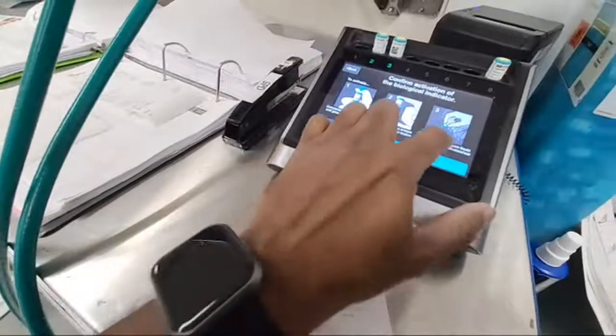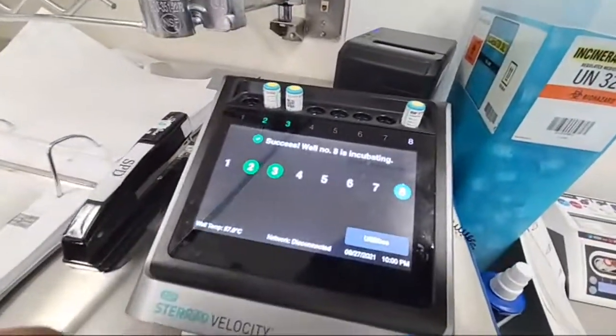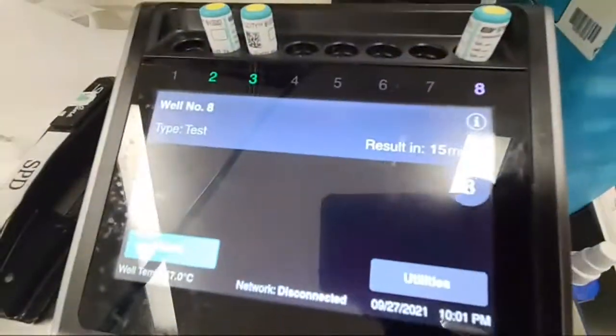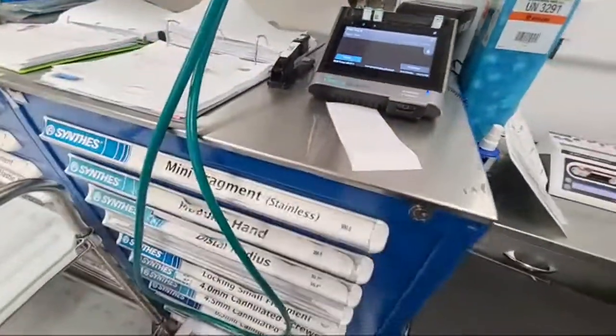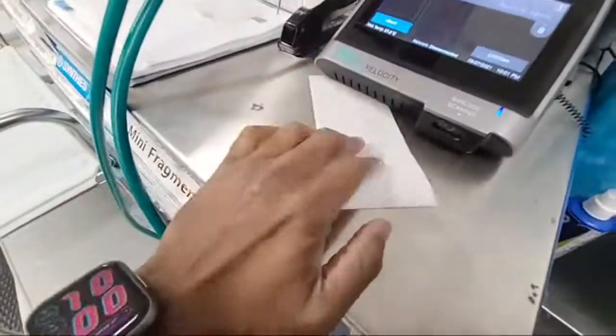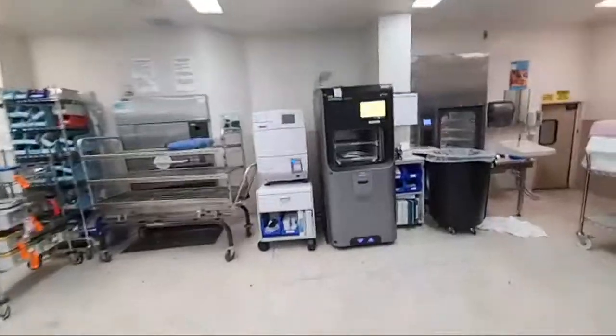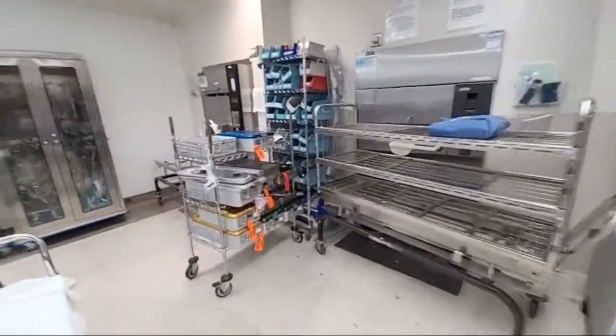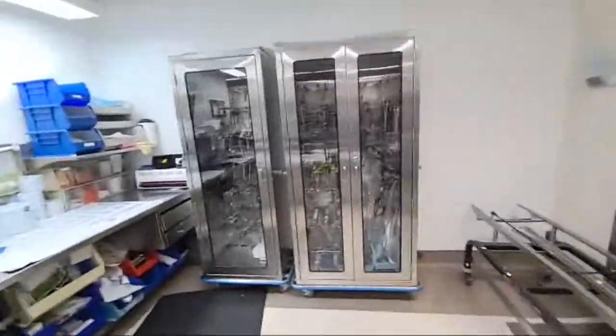Next. Yes. Activated. I've already activated. I cracked it. And so it's saying, okay. Here we go. And so now it says it'll be ready in 15 minutes, the result. And then I will, of course, initial this and write what that was running. So that was this hydrogen peroxide. The steam one, that's still going actually. That runs for about 5 minutes and then dries for 45.